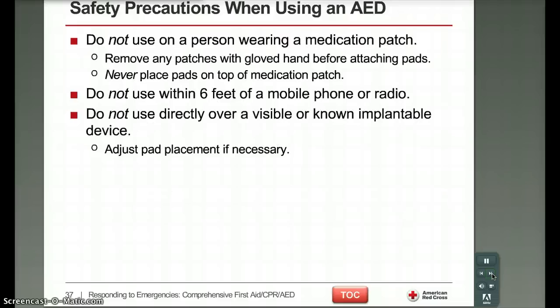Other precautions: do not use on a person wearing a medication patch. So anyone who has a nitroglycerin patch or something, we don't want to use it over that patch. We want to remove any patch with a gloved hand before attaching the pads. Never place pads on top of a medication patch. Many times it's people who are taking nitroglycerin because of their angina.